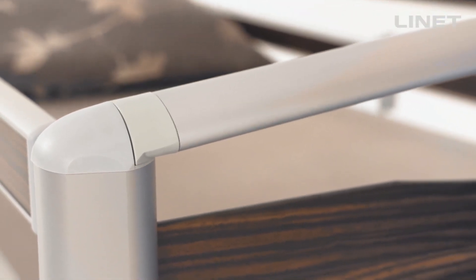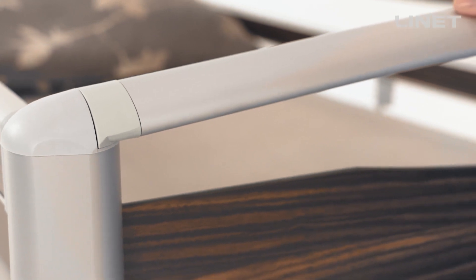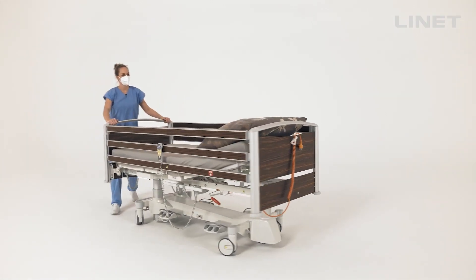It clicks when putting the bed end back, so the bed ends are very stable during transport.